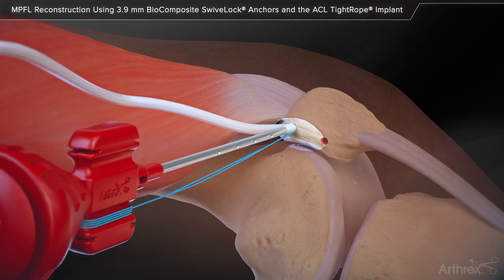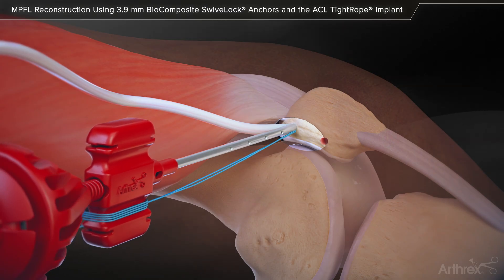Pass the suture tails of one graft end through the eyelet of the first 3.9 mm swivel lock anchor and push both the graft and anchor into the proximal drill hole until the eyelet is fully seated. Maintain tension on the suture limbs and screw the swivel lock anchor into the patella.